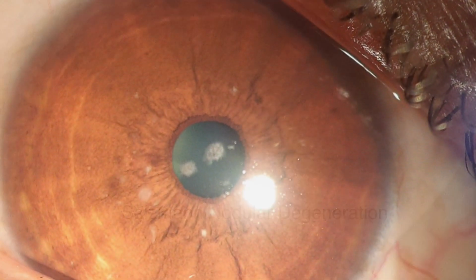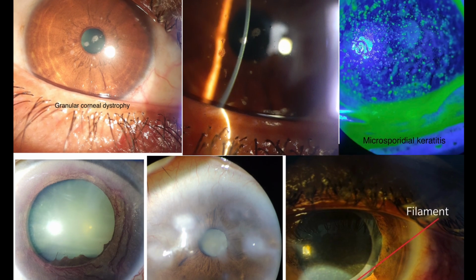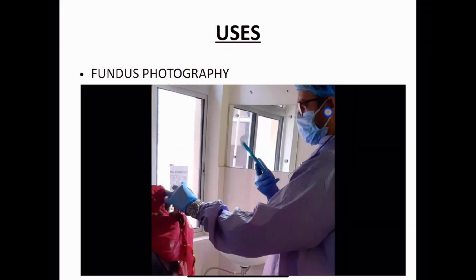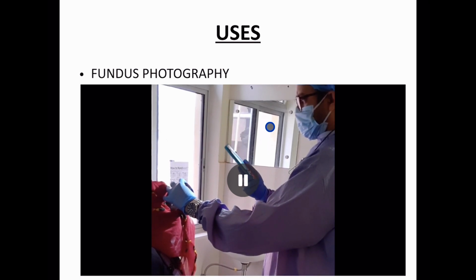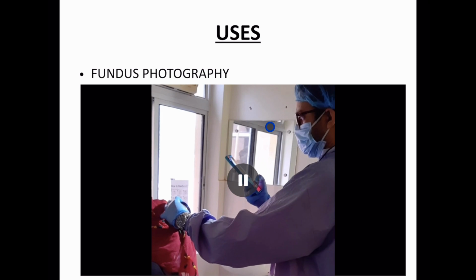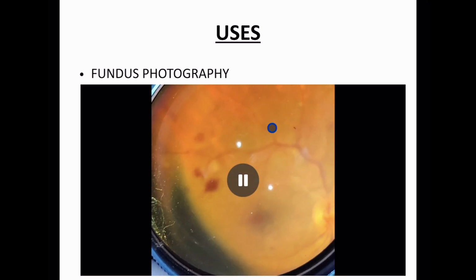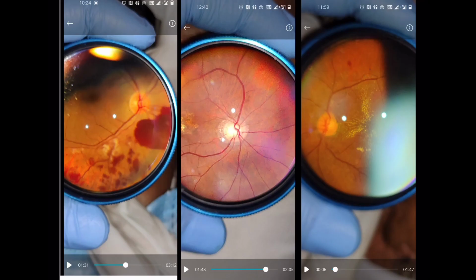Here are some sample pictures that I have clicked through this method. Another use of the smartphone is in the fundus photography. Here is the real life demonstration of the way it is used. Check out some sample pictures that I've taken through this method.